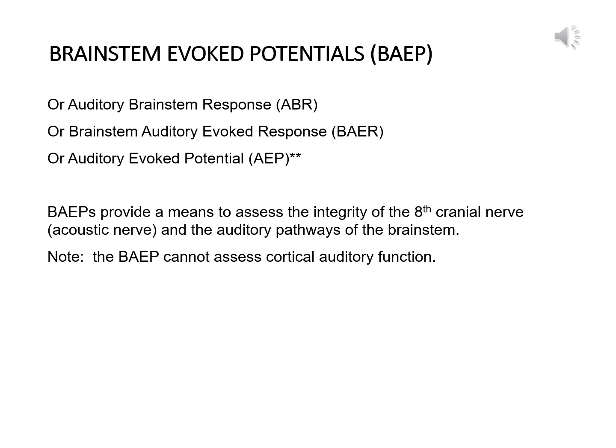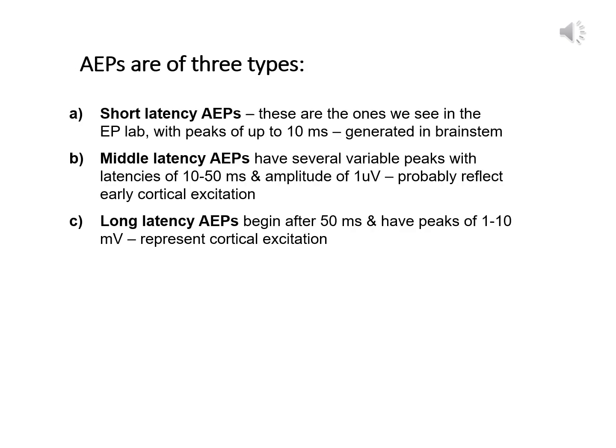Now, the BAEP, the brainstem auditory evoked potential, provides a means for us to assess the integrity of the eighth nerve or the acoustic nerve, and also the auditory pathways of the brainstem. Now, it's important to note, and I can't emphasize this enough, that the BAEP only assesses brainstem function, and so we cannot assess cortical function with this response.